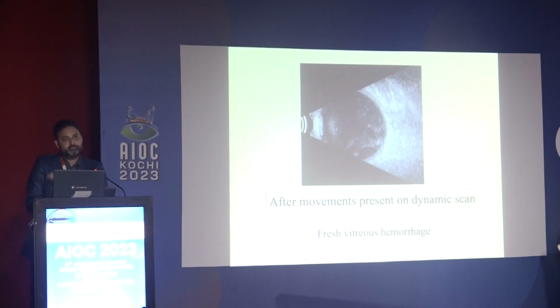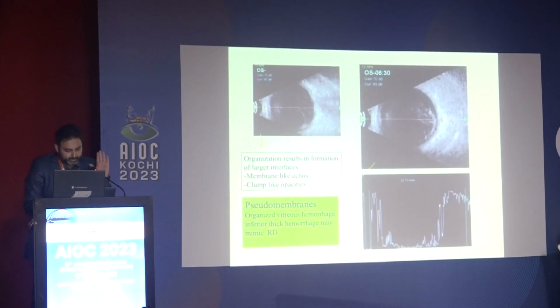There will be differentiation between fresh and old. Now, if you want to look at, now this is old. Once, like anywhere else in the body, once there's blood present anywhere long enough, it'll dehemoglobinize. It'll also start to maybe try and get thicker. It might get fibrosed. Basically the body will try and clear it. And the steps till clearing are all of those.